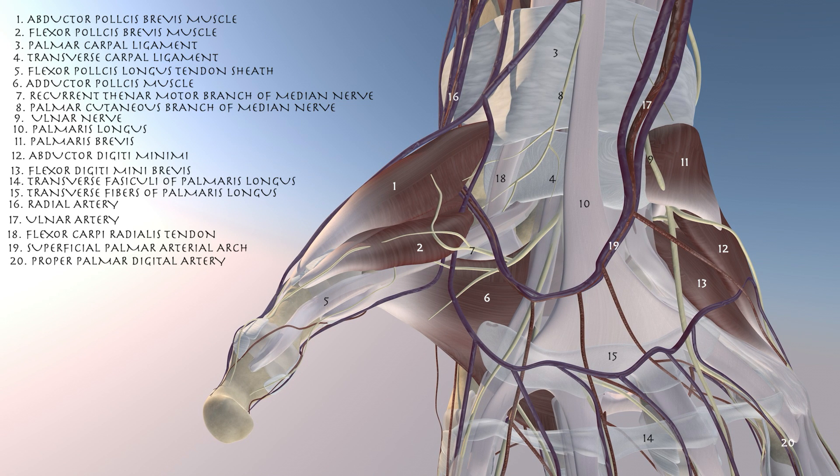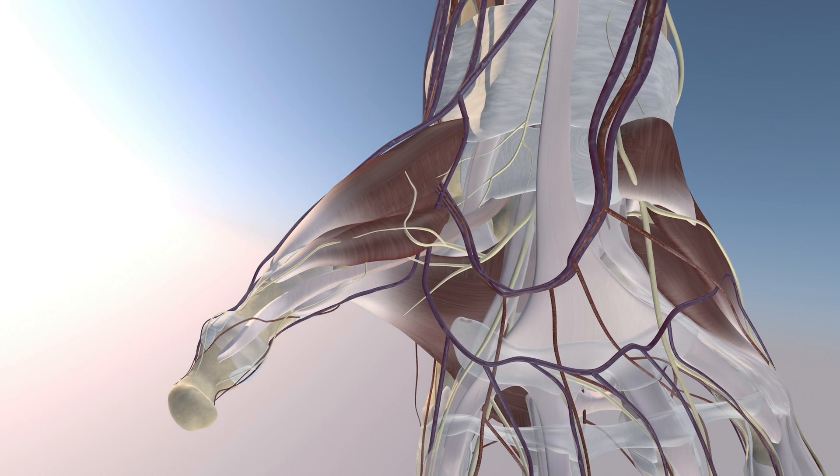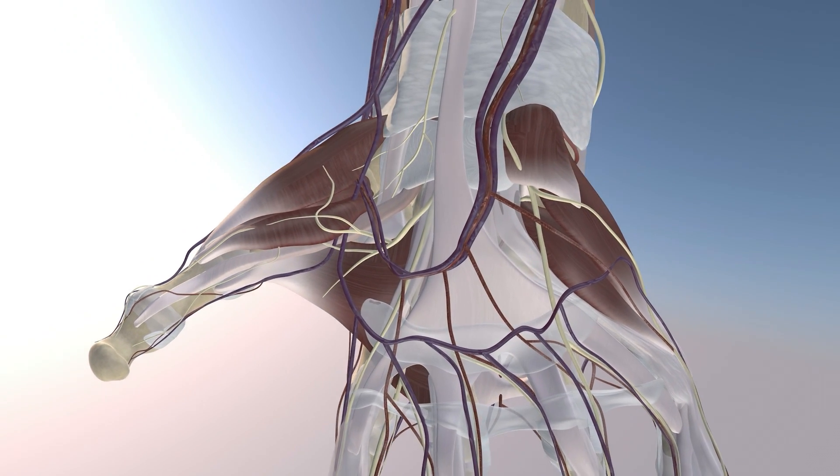Here we're going to go through a trigger thumb injection. We're going to focus on the anatomy around the flexor pollicis longus tendon, where you can see the flexor pollicis brevis muscle just overlying that tendon. And overlying that muscle is the abductor pollicis brevis muscle. Here we just remove the tendon sheath of the flexor pollicis longus tendon.